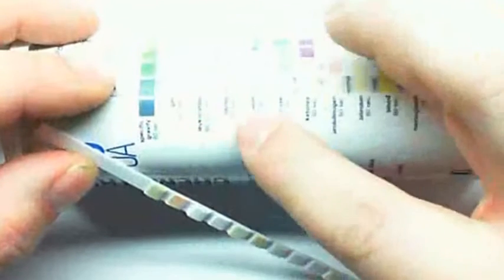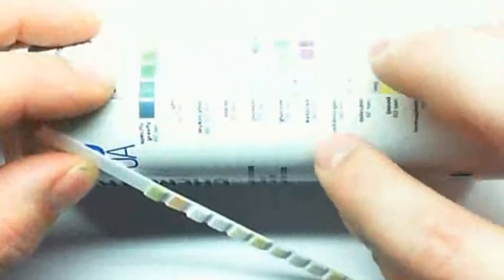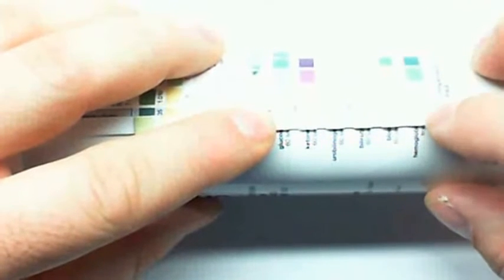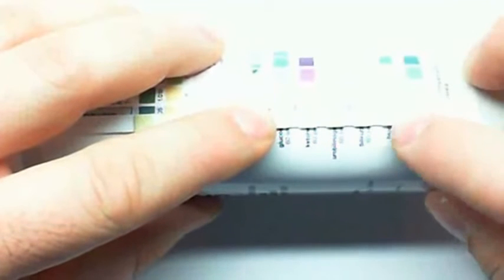Everything underneath the strip handle is a normal value. So under there we've got specific gravity, pH, leukocytes or white blood cells, nitrites, protein, glucose, ketones, urobilinogen, bilirubin, blood, and you can also test for hemoglobin using the same exact pad. The last little pad is the compensation area, and that is just for white balancing when this is read off automatically with machines. One thing I will point out before we get started is you'll slide this last pad back and forth because the single pad is used to read blood or hemoglobin. We'll get to that in a second.